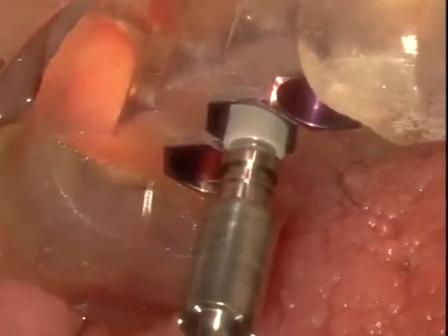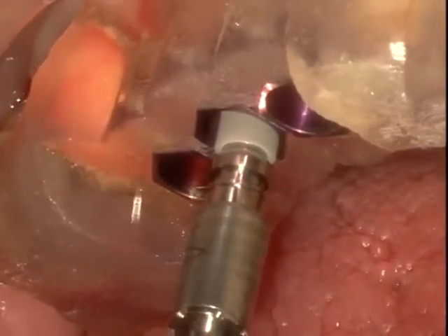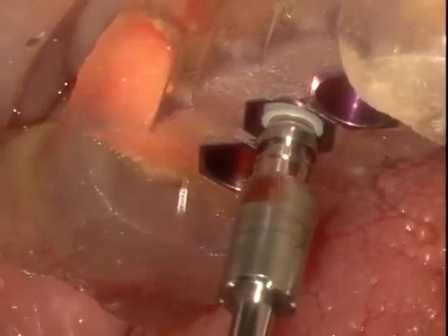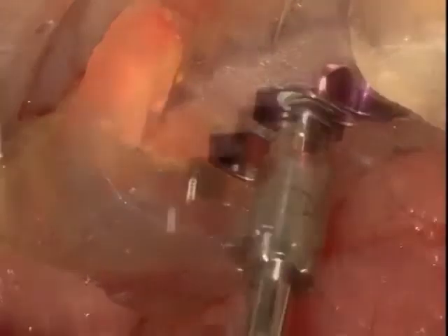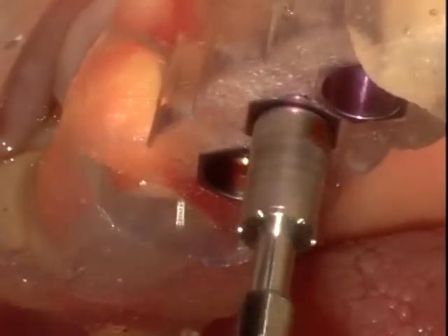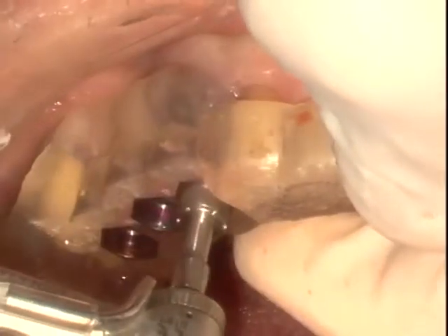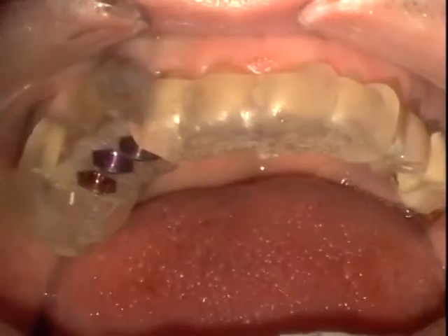We place a little bit of water irrigation as we initiate the placement of the implant into the osteotomy site. A little bit of heme, and torquing this down into its final position, as well as the area of the extracted canine. Again, you can see going down to 30, then 40, and then 45 Newton centimeters. Precise flattening of the top of the placement screw with the top of the surgical guide.